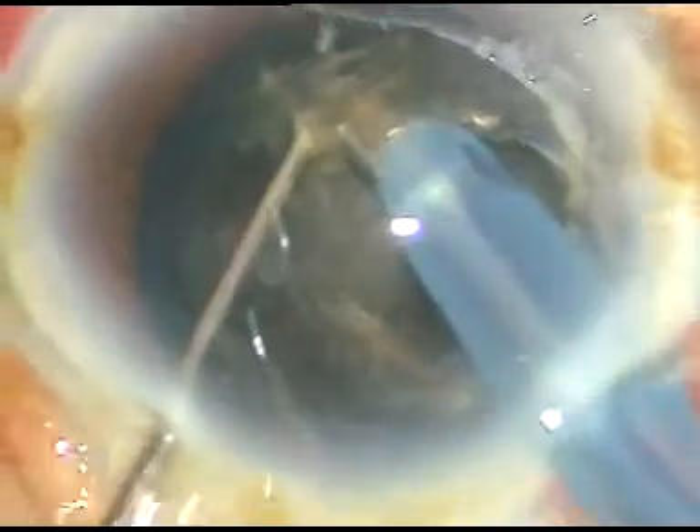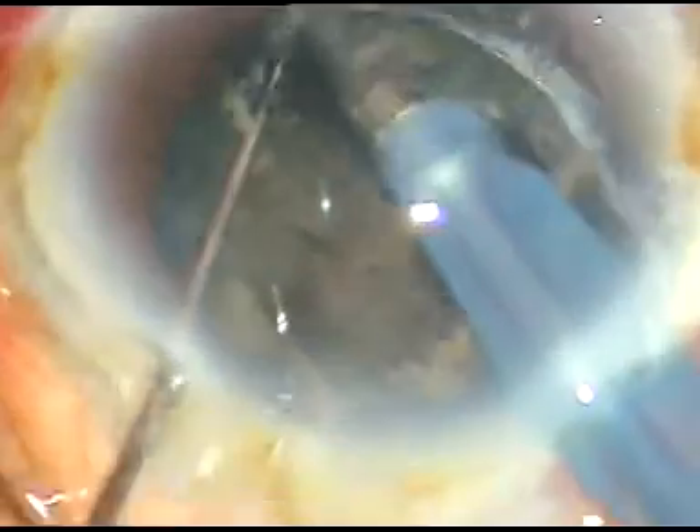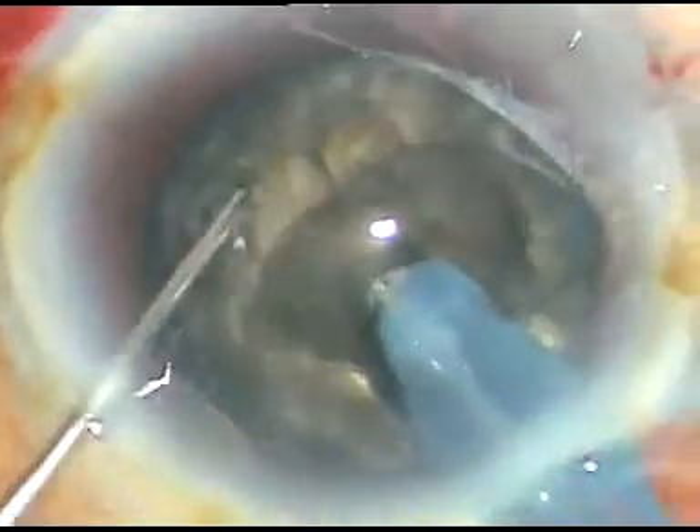Now I am trying to chop the nucleus. This is the first chop — I engaged at the edge of the crater and made this chop. Now I am rotating it 180 degrees, going to the other side, holding the nucleus here and trying to separate it. I want to divide this nucleus into two hemi-nuclei. Yes, it has divided into two hemi-nuclei.